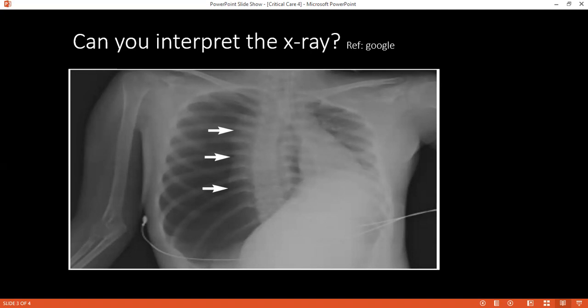What else can you see? I can also see, is there any tracheal deviation? Can you see any tracheal deviation? Yes, there's midline shift, and there's tracheal deviation to the left side. Right, midline shift to the left. What's happening in the lung view? The costophrenic angle on the left side is obliterated because of the shifting of the mediastinum.